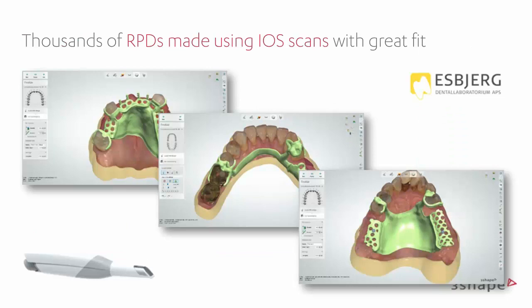Just looking at RPDs, we don't have so much time to talk about the software today, so we're going to skip over that, but there's really good software. What I think is still a little bit cutting edge is that the RPDs can be done on Intra Oral Scans, and we have done tens of thousands of RPDs with the Trios and with great fit. You have a mucostatic impression, which is easily taken with the Trios, and you get the bite from the teeth.